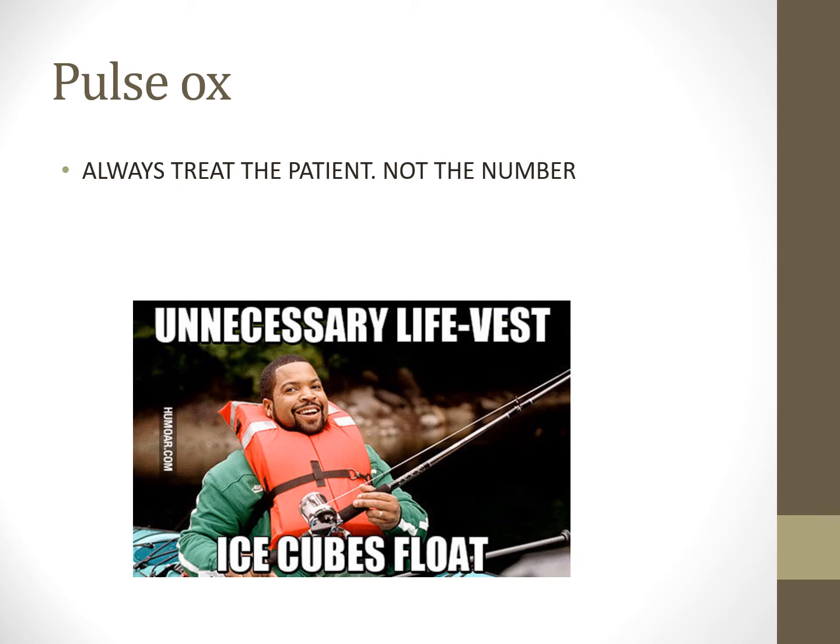So whatever machine or whatever monitoring you have, you always start with the patient, work back. Don't just assume it's machine error. Start with the patient and work your way back. It could very well be a machine error. It could very well be that the pulse ox just came off on the bed and the patient actually doesn't need any oxygen intervention, really.